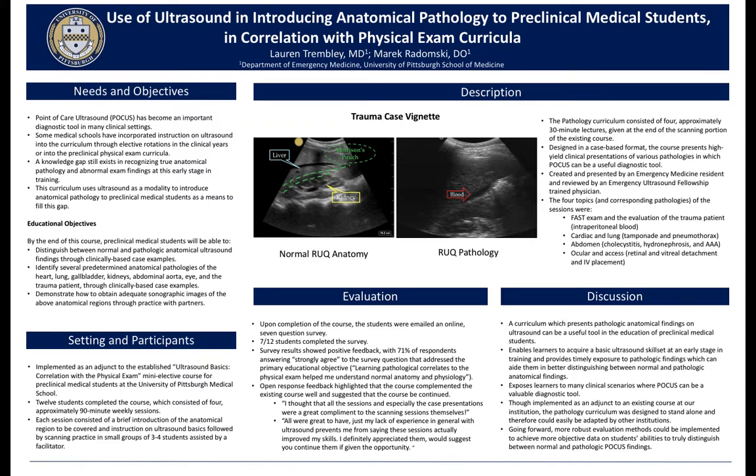However, I feel that there are still many strengths to this novel course. First, it enables learners to acquire a basic ultrasound skill set at an early stage in their training, preparing them for more advanced practice during their clinical rotations. Next, by using a case-based format, it provides students the clinical context of high-yield diagnoses that can be made by point-of-care ultrasound. Finally, it exposes learners to anatomic pathology at a time in their training when they are overly exposed to normal findings. This enables them to better distinguish between normal and pathologic anatomical findings.